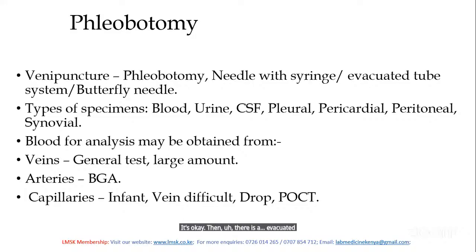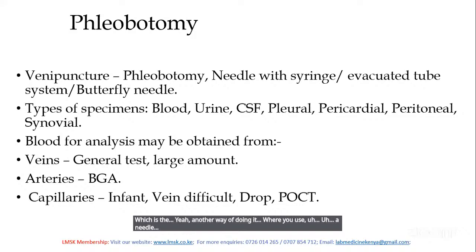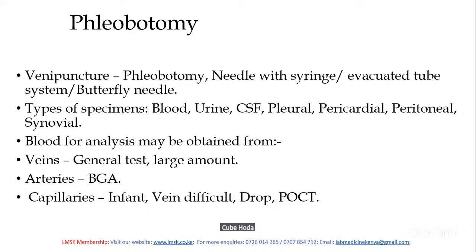Then there is the evacuated tube system, which is another way of doing it, where you use a needle and a specimen holder, a tube holder, where you fix the needle in this tube holder, then you puncture the vein.